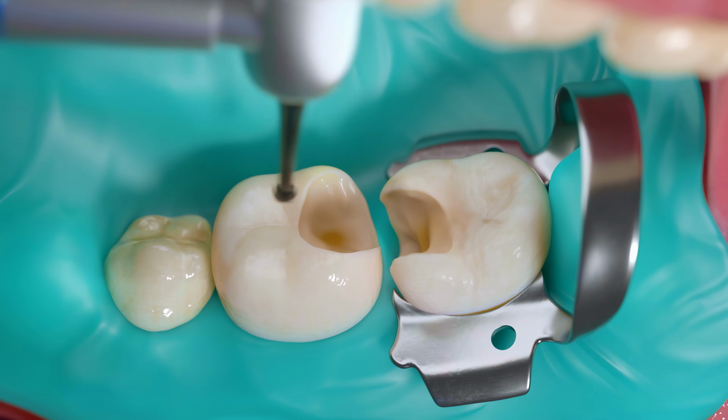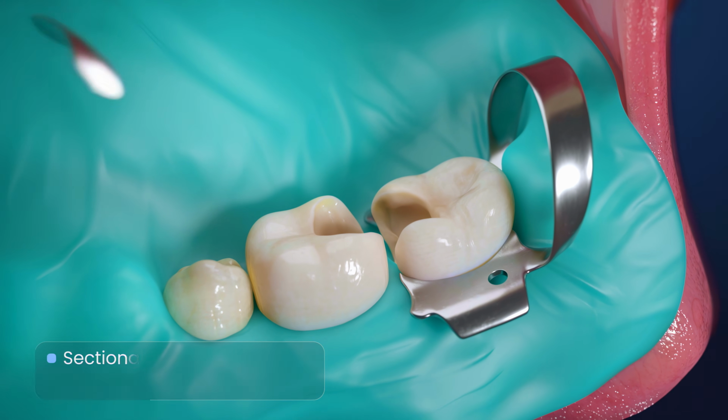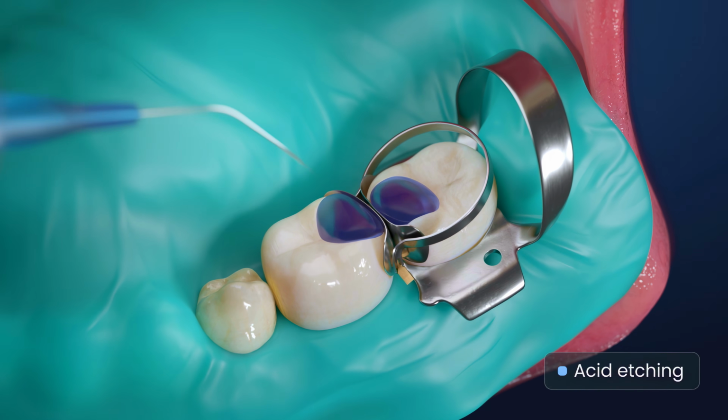Enamel preparation is performed using rotating diamond burs at high speed with air-water cooling, while infected dentin is removed with carbide burs at low speed. Sectional matrices, adapted with wedges and a ring, are used to create the correct contact point.